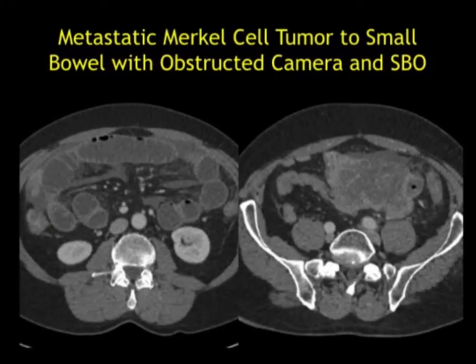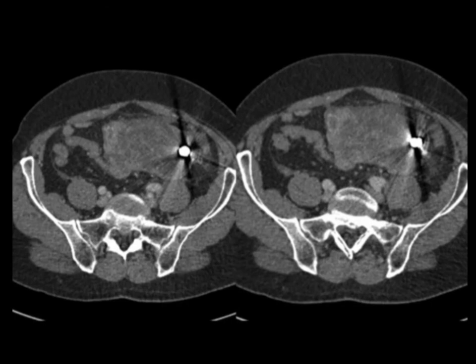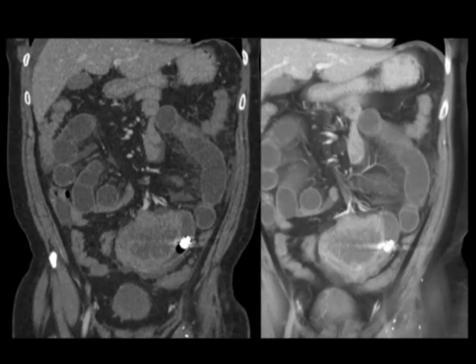A problem with capsule endoscopy is capsule retention or obstruction. We saw this patient with bowel obstruction, followed it down to a very large mass — a large tumor in a patient who previously had a Merkel cell tumor, now with metastatic Merkel cell tumor causing bowel obstruction. For whatever reason, it was decided to give the patient a capsule — and there's the capsule, not going very far, with a huge mass obstructing it. The capsule can only be removed surgically. This is a very impressive example of metastatic Merkel cell tumor causing capsular obstruction, as confirmed on the topogram.